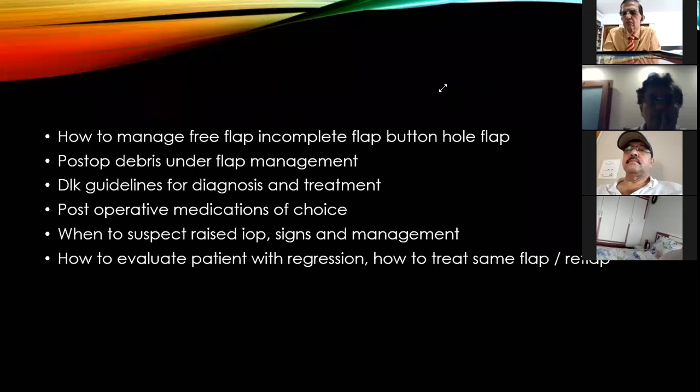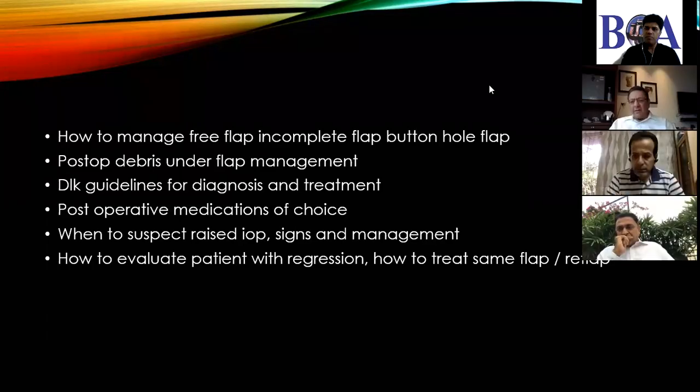Go ahead and, I mean, if you got a goodish bed, not if you got a ragged bed, but go ahead and do your laser. Then gently pull him out of the keratome. The important thing here to realize is the side that is facing you when you invert your keratome is the stromal side, and bring that down into the bed and then just float it into place. It's not an issue.